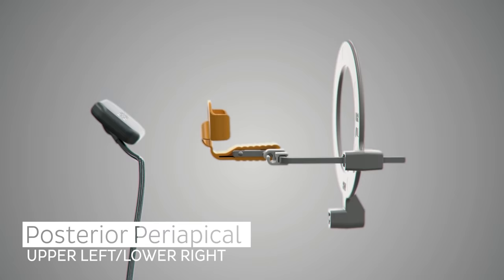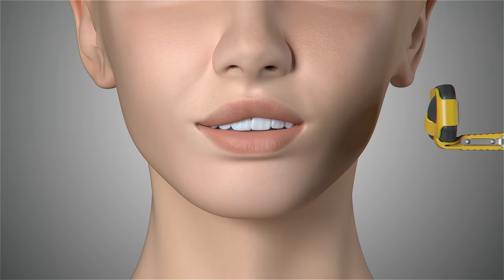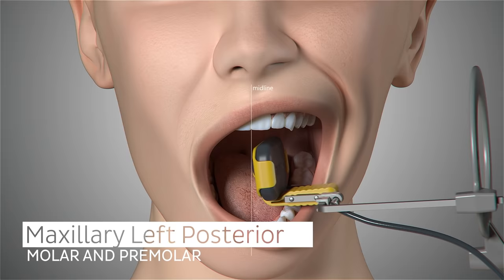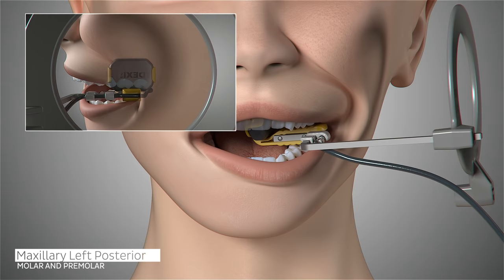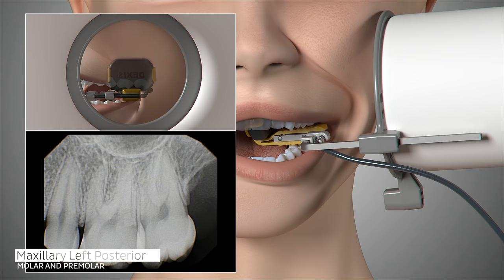The configuration of the sensor and holder will now change for the next set of images in our series, the maxillary left periapicals. Position the sensor in the patient's mouth toward the midline of the palate, parallel to the roots of the molar and centered on the second molar. Ask the patient to close and slide the aiming ring as close to the patient's cheek as possible. The cone of the x-ray emitter must be placed flush with the aiming ring and then trigger your exposure.